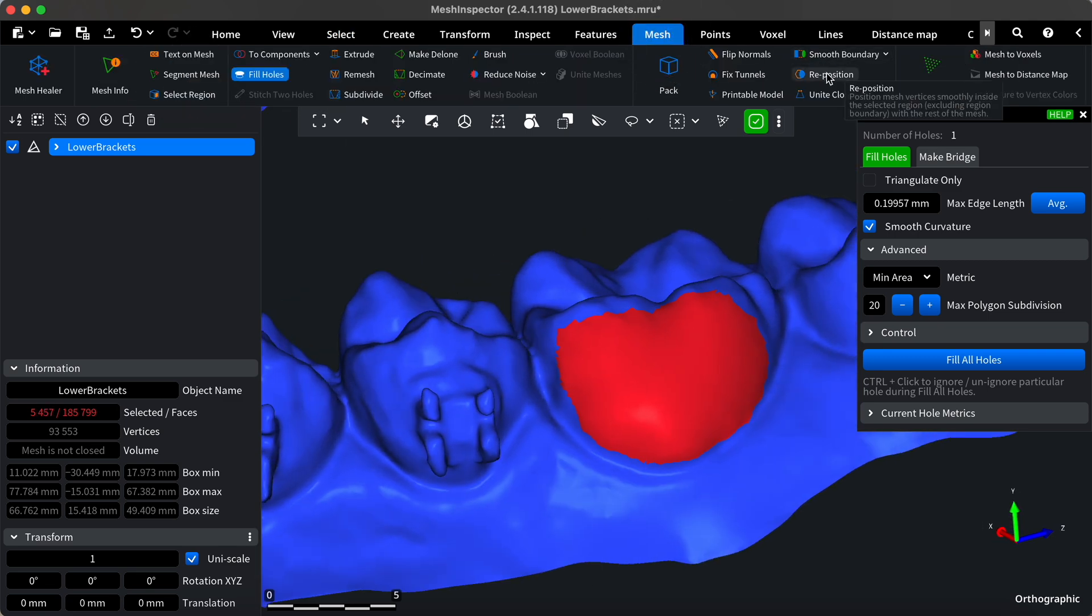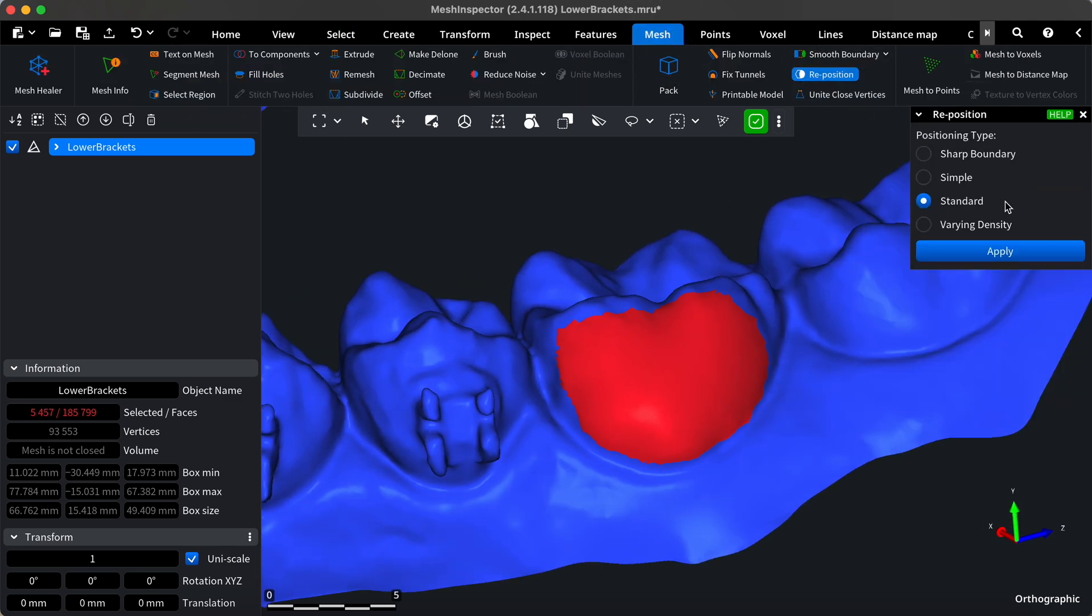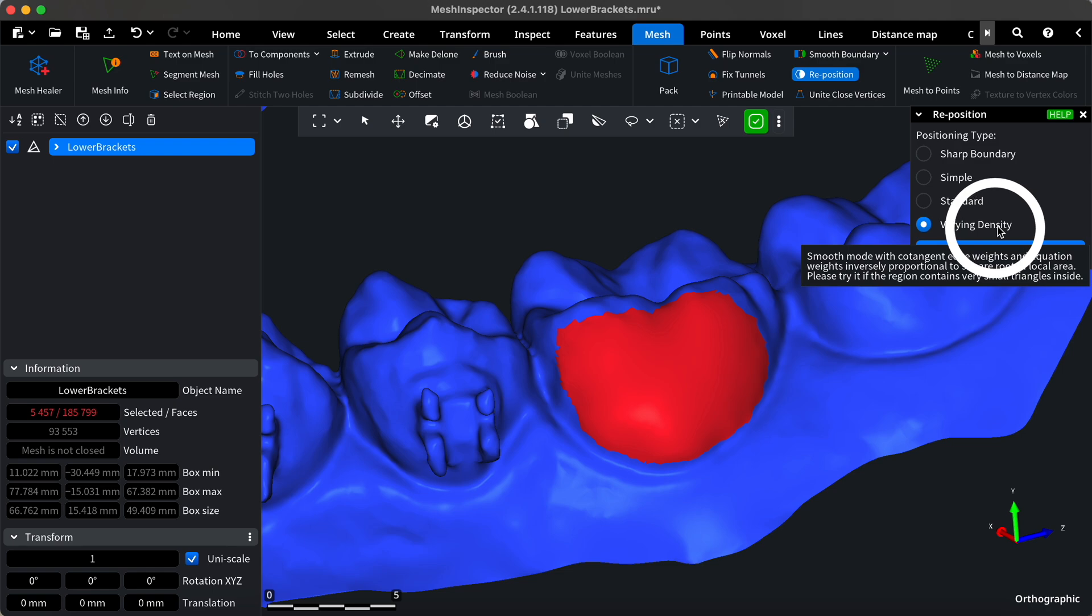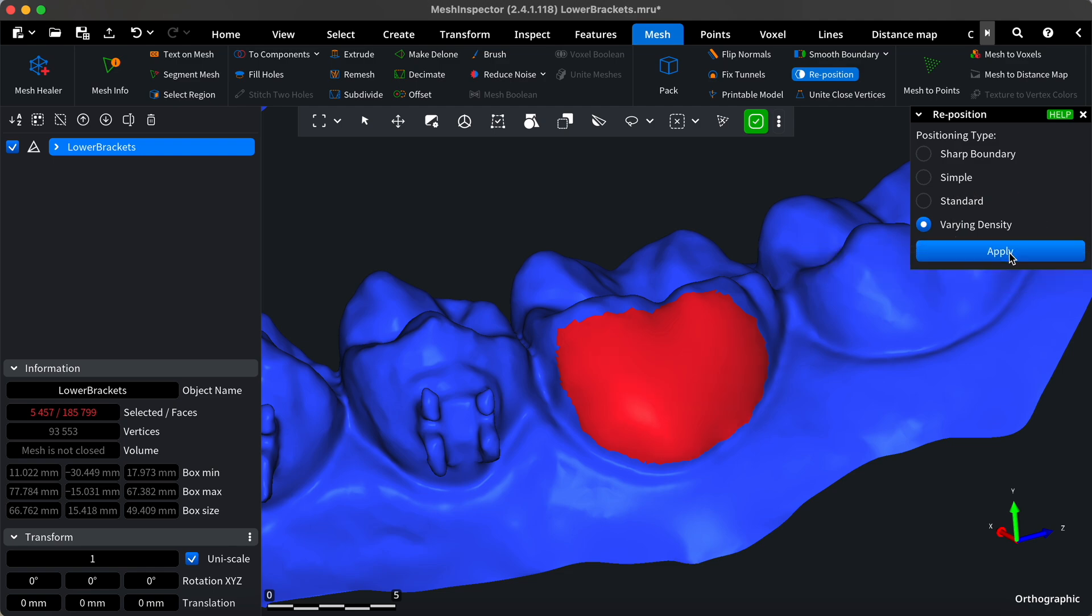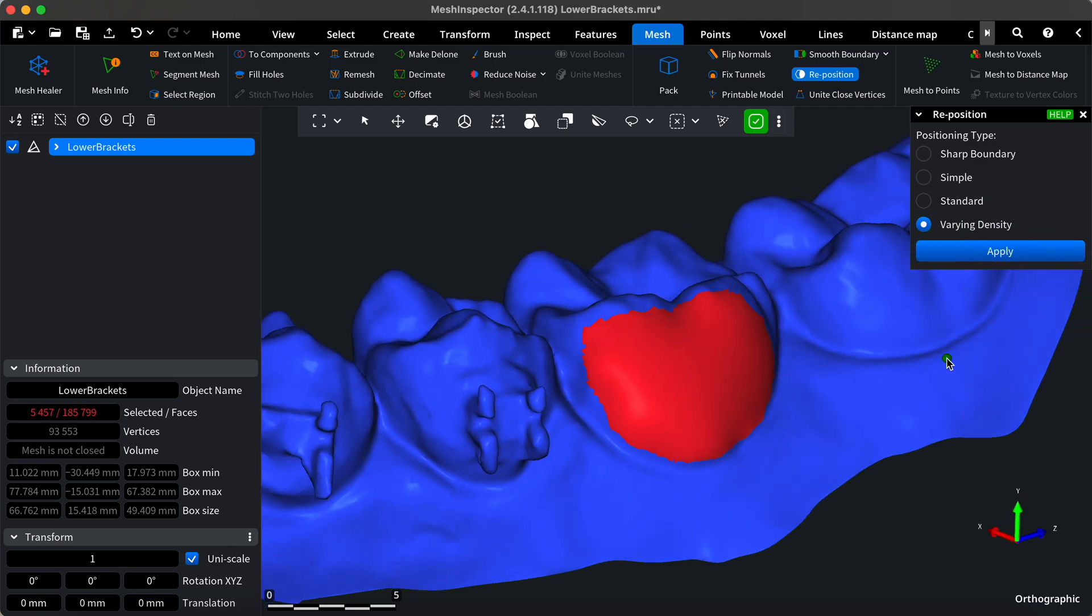Then, use the reposition tool with varying density mode to reposition the vertices accordingly. Perfect!